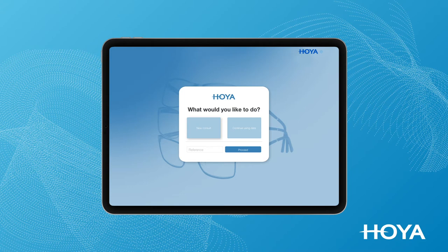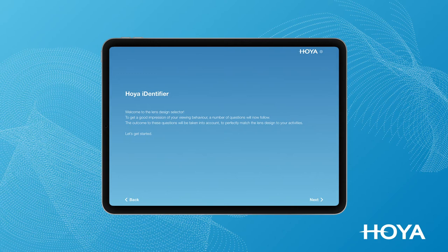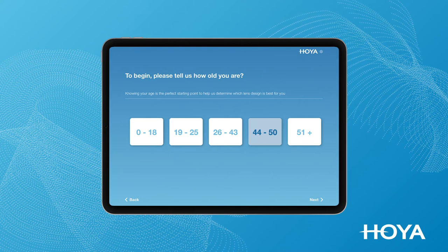Identifier will then guide you and your patient through several lifestyle questions to help discover the perfect lens design direction. Start by entering your patient's age range, then assess how they spend their time and what devices they use throughout the day.